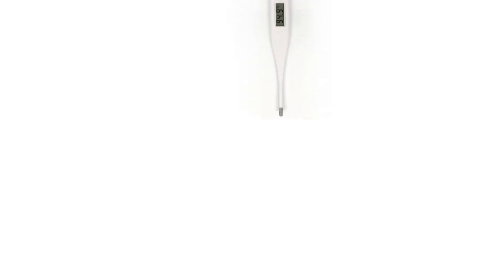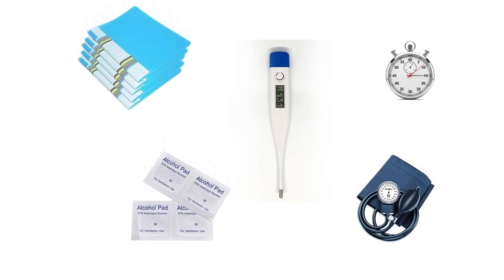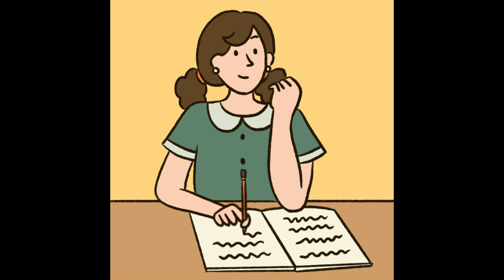For checking vital signs you need to have the thermometer, stopwatch, BP apparatus, alcohol swab, and a case file for documentation.